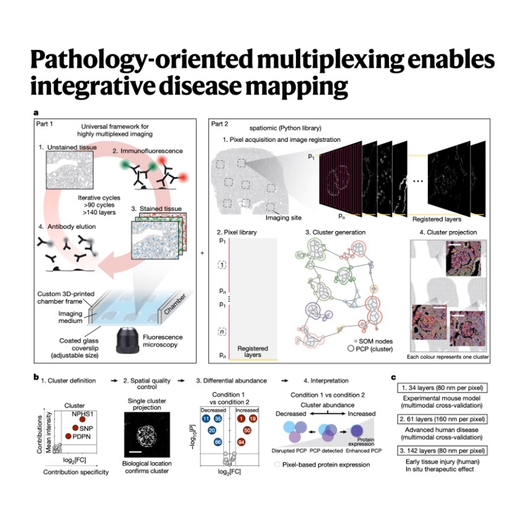Fibrosis, yeah. Right. The abundance of that ECM cluster showed a significant inverse correlation with eGFR. So, as the subcellular signs of scarring increased, the patient's overall kidney function decreased. It builds a direct bridge from the pixel-level pathology to the patient-level outcome.